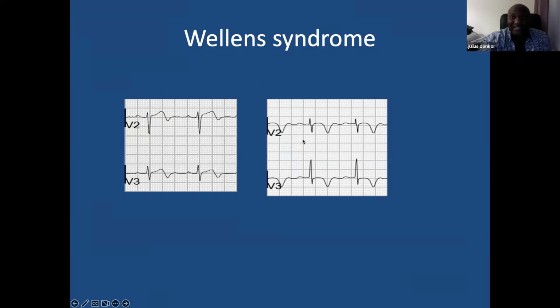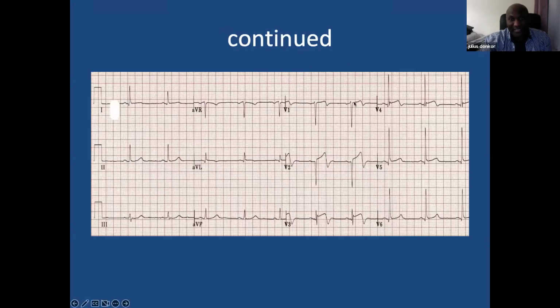So this is your LAD block as well, and watch out for that. This is a really good example on a 12-lead ECG of what it looks like. You can see that biphasic T wave.